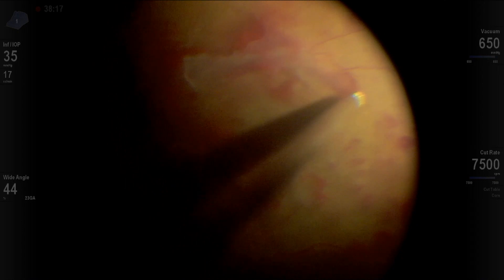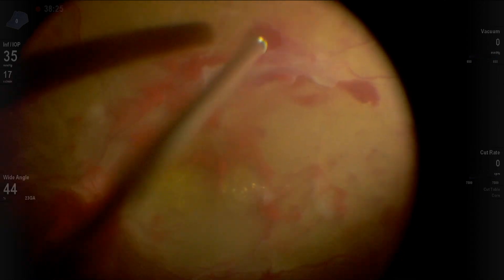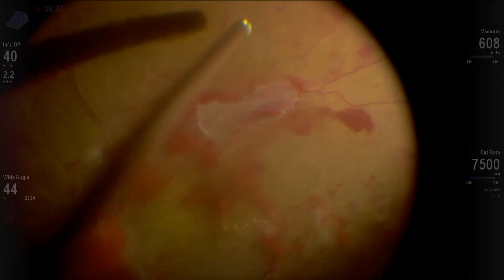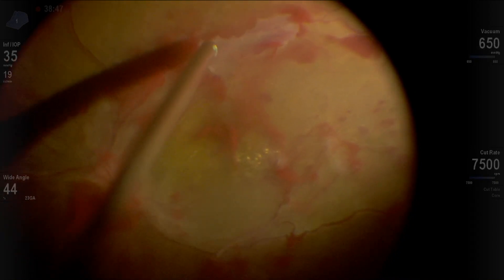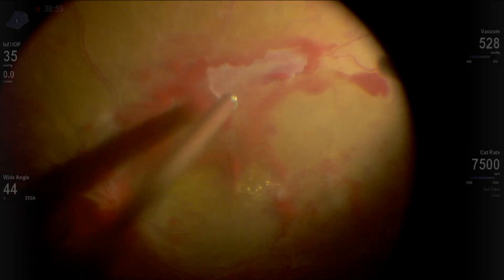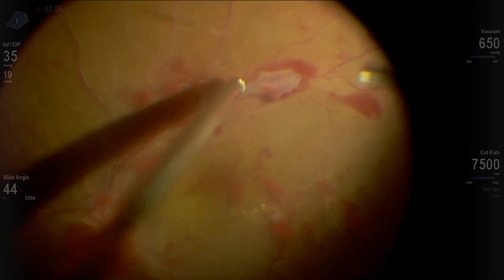Now more direct attack here by the cutter — we can access under the membranes. Remember, in a closed space 27 gauge is better, but when you're working and you want to do a cutback delamination where the membrane flows backward, actually 23 gauge is much better because then you have a larger sphere of influence and everything is going to fly to you, as you can see here.